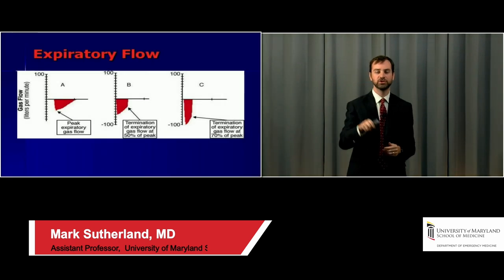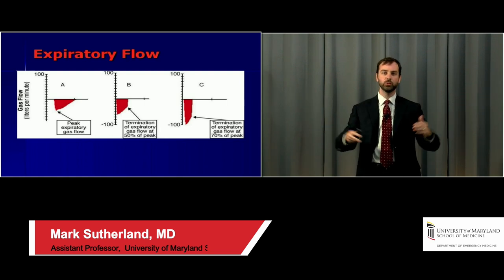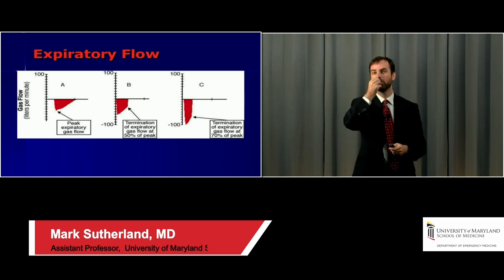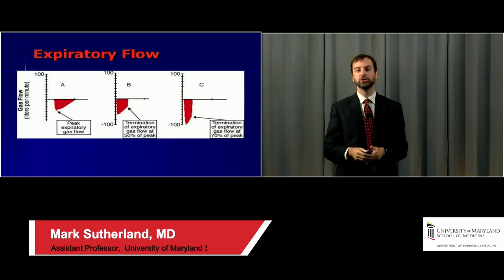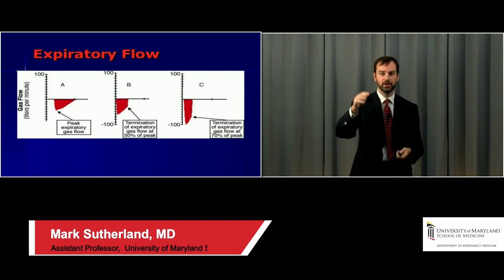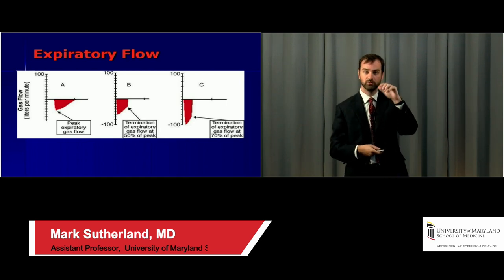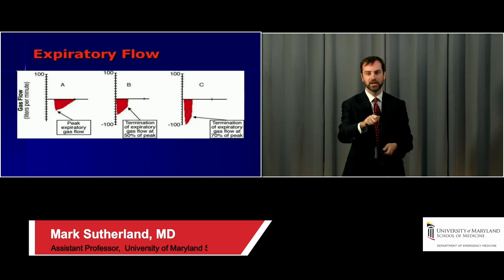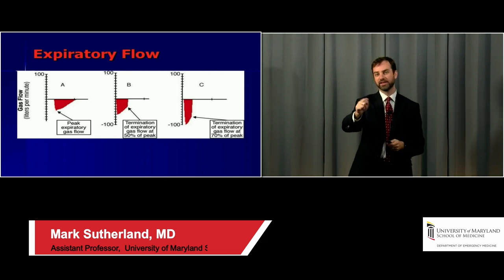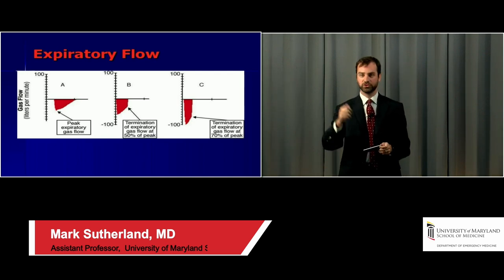So this is the explanation I mentioned before in terms of expiratory flow. Diagram A there is kind of an infinite, if you will, time for expiration. You have a peak in expiration, then it trails off. What you're doing is titrating your T low so that you end up with diagram C there. You can actually pause the waveforms on most ventilators. If you look at diagram C, if your peak expiratory flow is roughly minus 100 liters per minute, you use that little scroll wheel and find the point where it's minus 70, minus 75, something like that. And if that's 0.4 seconds into the expiration, you hit 0.4 as your T low, or whatever the case may be.